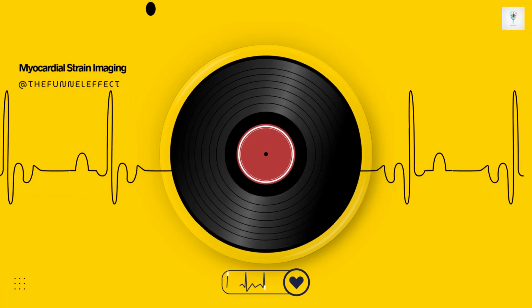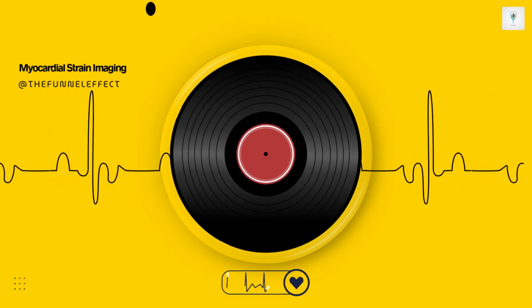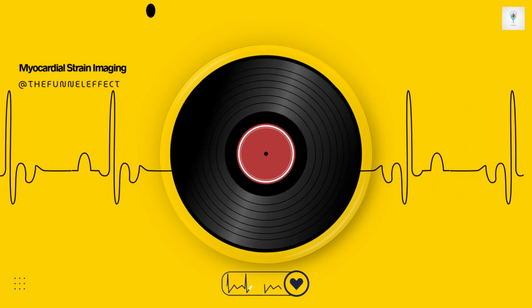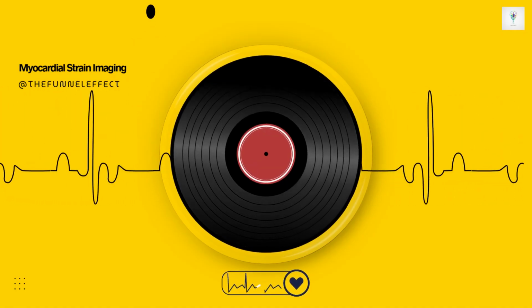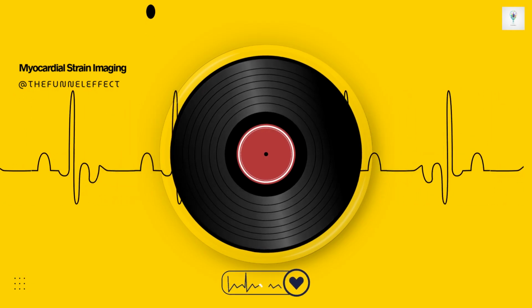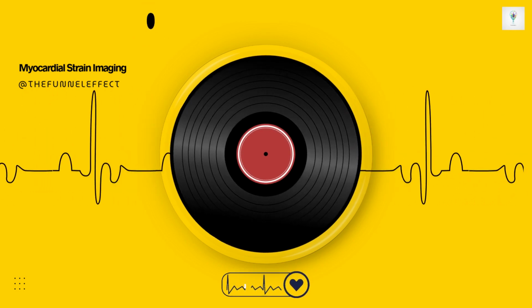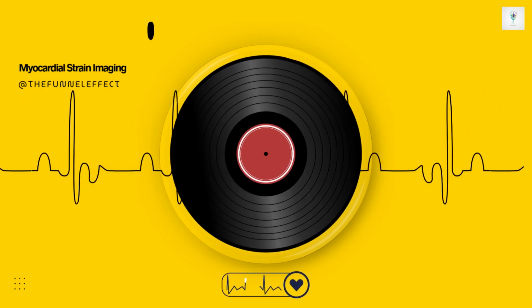Interesting. Any other strain markers for CRT response? The myocardial work analysis we talked about is also proving useful here. Looking at the difference in myocardial work between the early activated septum and the late activated lateral wall seems to correlate strongly with successful therapy and reverse remodeling. More work difference suggests more potential benefit from resynchronization. Let's shift to cardiomyopathies, diseases of the heart muscle itself. Strain seems incredibly powerful here for diagnosis and prognosis, especially where EF might be misleading.